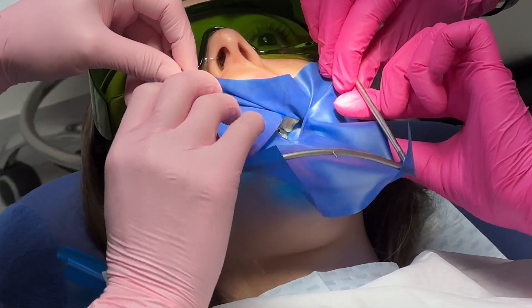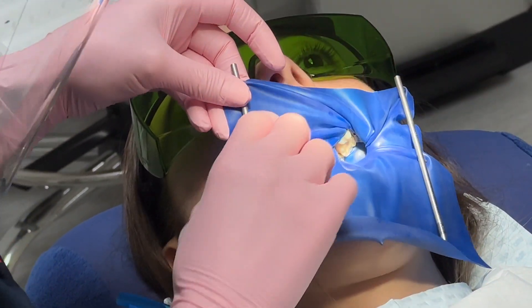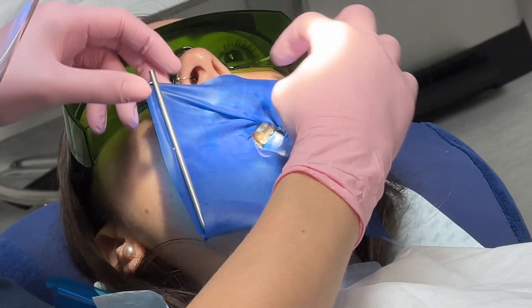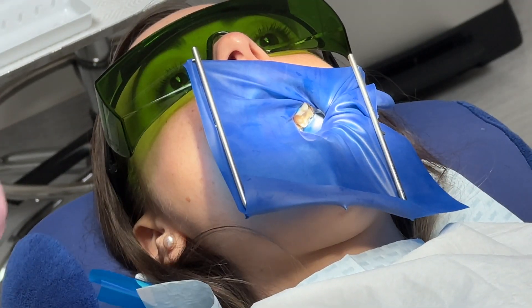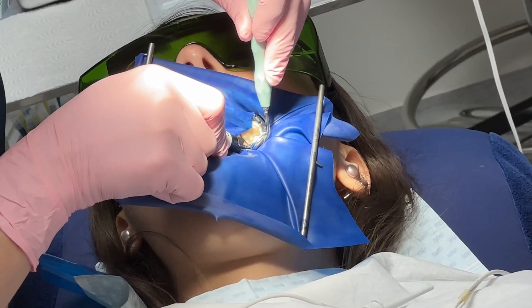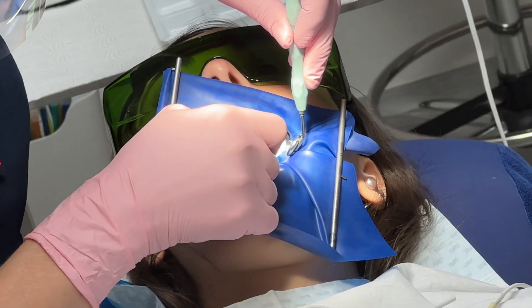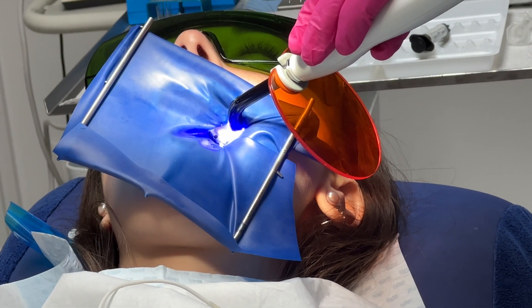It is used mainly in endodontics, fixed prosthodontics, and general restorative treatment. Its purpose is both to prevent saliva interfering with the dental work — for example, contamination from oral microorganisms during root canal therapy — or to keep filling materials such as composite dry during placement and curing, and to prevent instruments and materials from being inhaled, swallowed, or damaging the mouth.